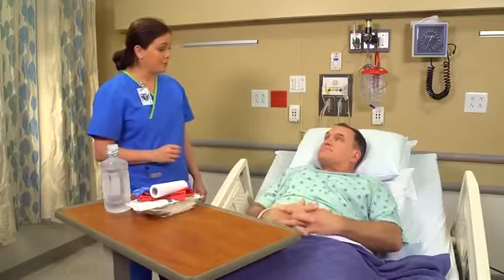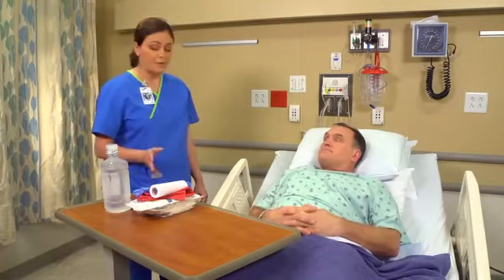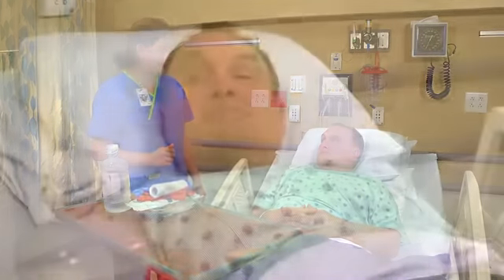Can you tell me your name? Gary Fulton. And your birth date? 6-14-1954. As you explain the dressing change process to the patient, assess his pain level. Check that the prescribed analgesic administered 30 minutes prior has taken effect.